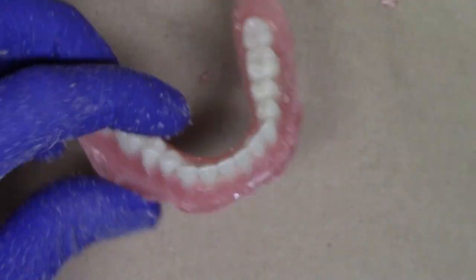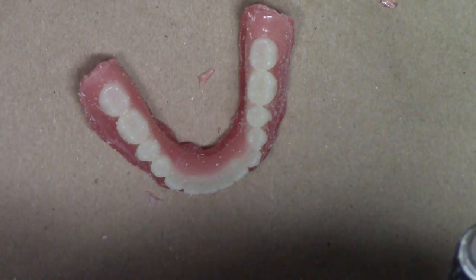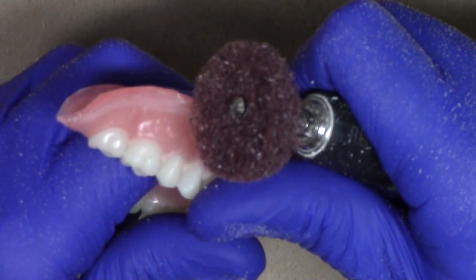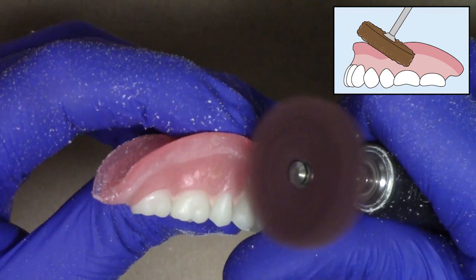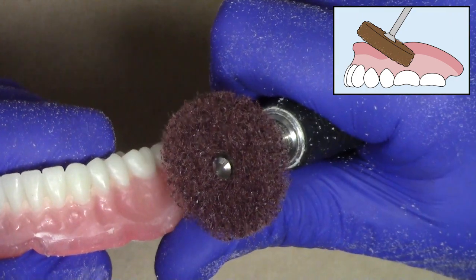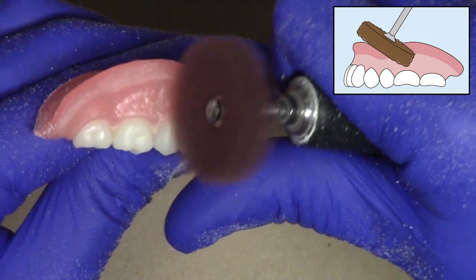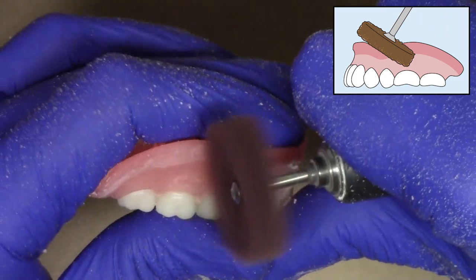Now what I'm going to do is go ahead and take my finishing wheel by removing my coarse and placing on my finishing wheel. And this is going to help finish up the cleaning up process. Using my finishing wheel at a low speed, I'm just going to rub the edge of the denture from the edge of the liner inward. I don't want to come this direction because it's going to spin that direction. What I notice is that I want to pull against the liner, so that way I'm not peeling the liner away from the denture.